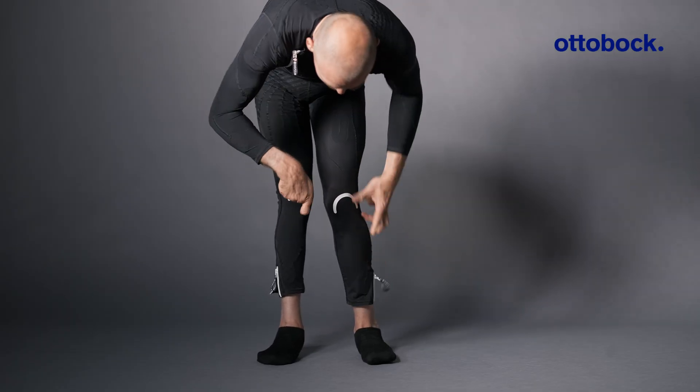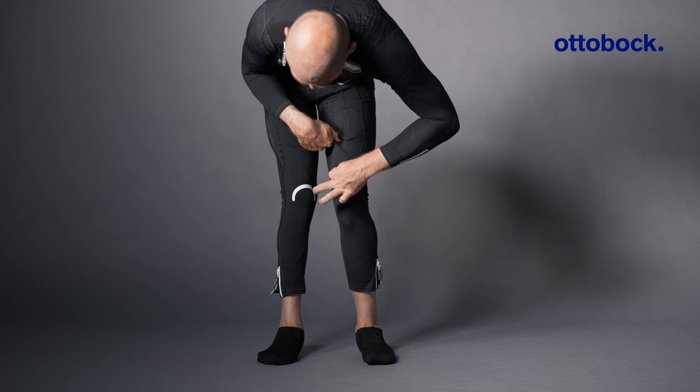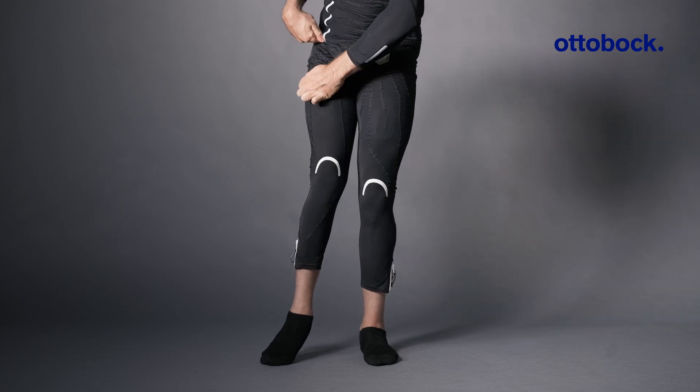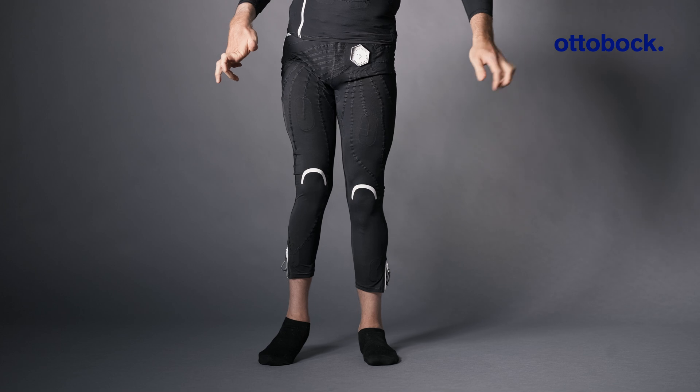To ensure effective stimulation, it's important that all electrodes are correctly positioned and in full contact with your skin. Make sure that the pants are pulled up properly and that the white guideline is positioned above the kneecap.